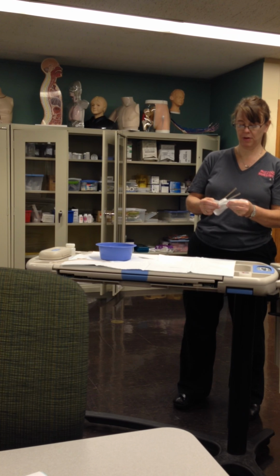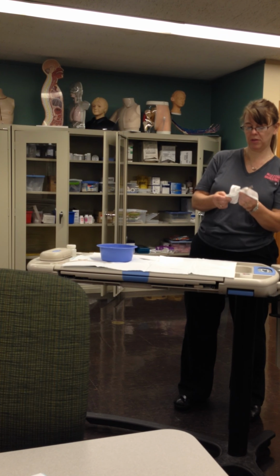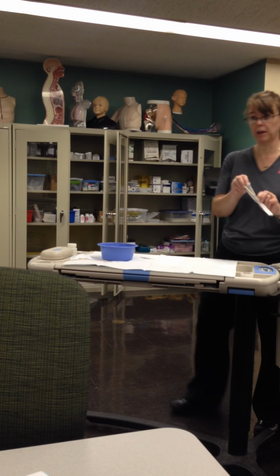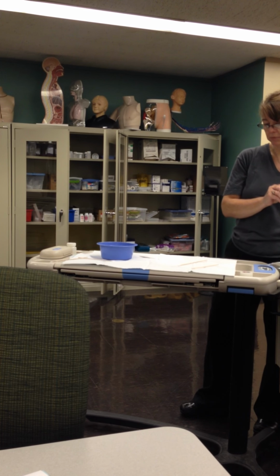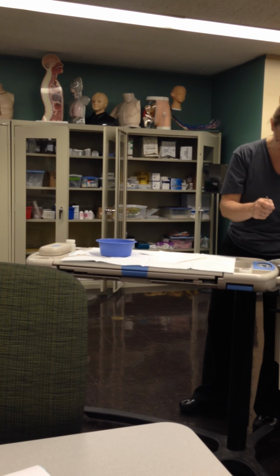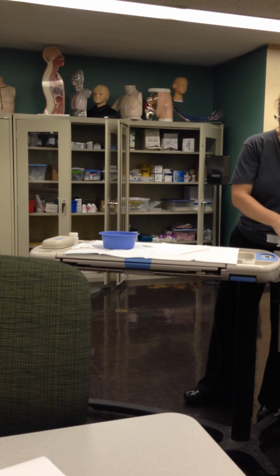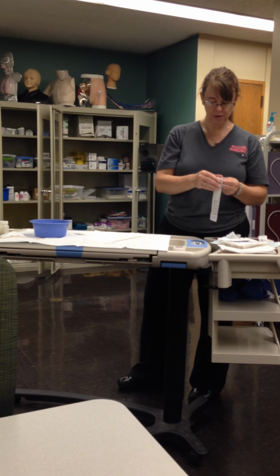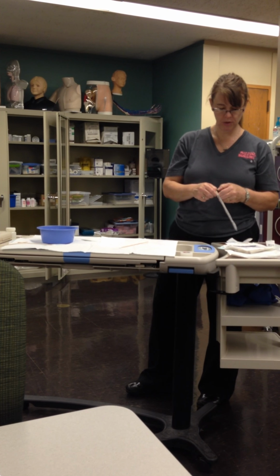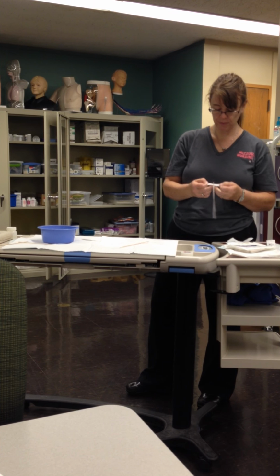So, all right. And then what we always did was just kind of, like you were talking about, from the side, and just threw them out. Oh, and this one has no cotton whatsoever on the end, so there you go. You know, so there are different ways you can do these. We'll do this last one, and then you guys are going to split up and critique each other.